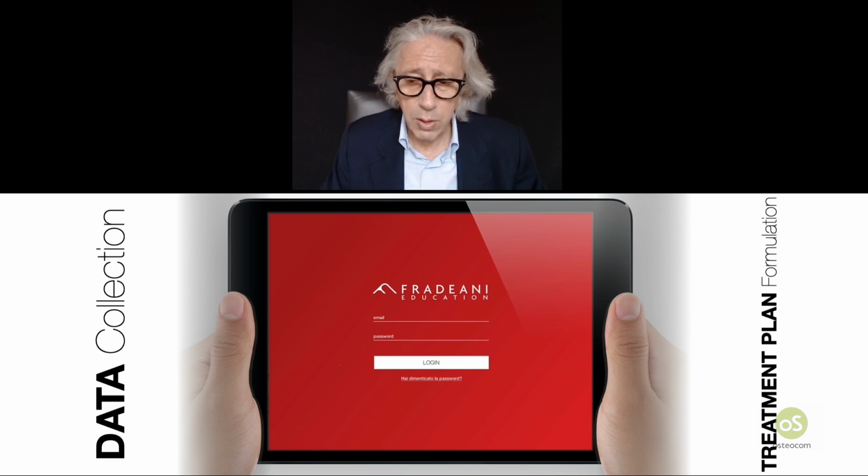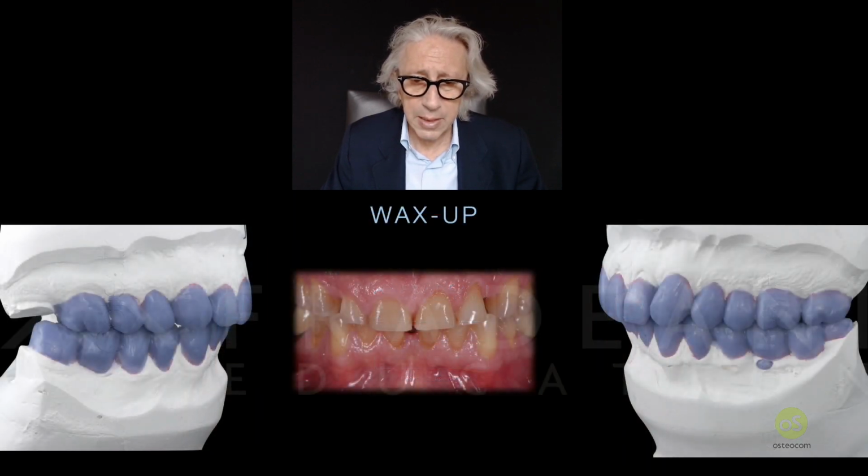So anyway, what you have to do is summarize and collect all the data. Again, the study models, facebow, and then the CR record, the protrusive record, and then all the data about what to do and how to modify, with the static checklist, the lab chart, and today the app.